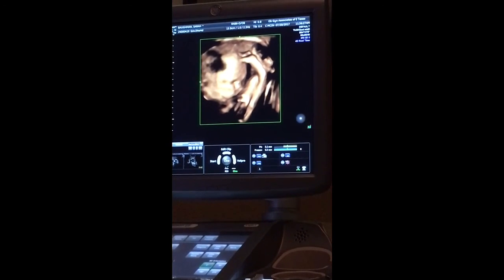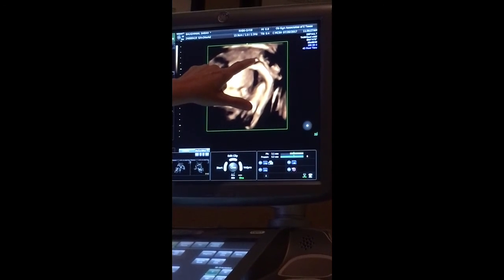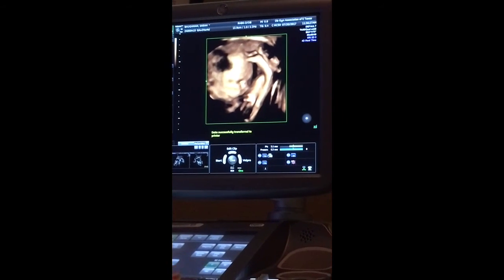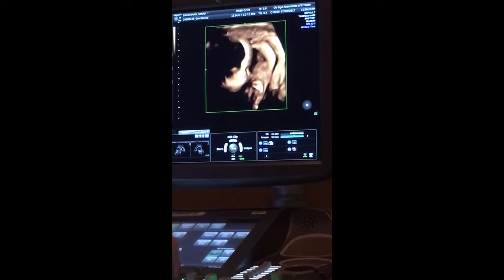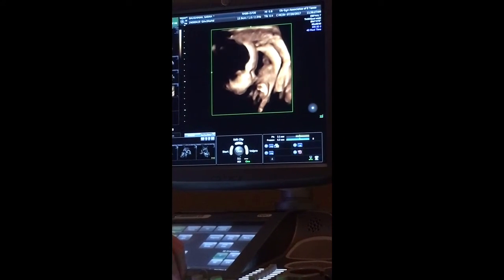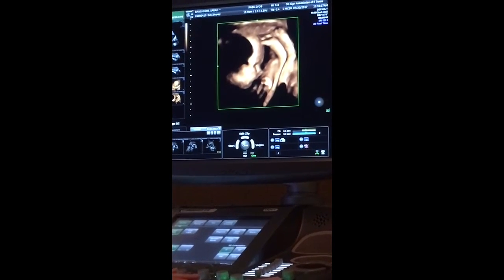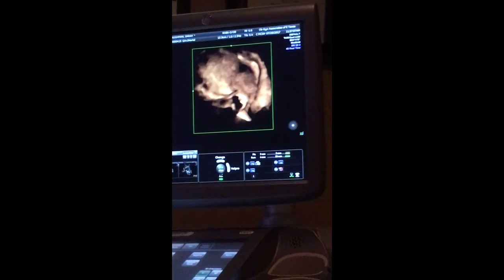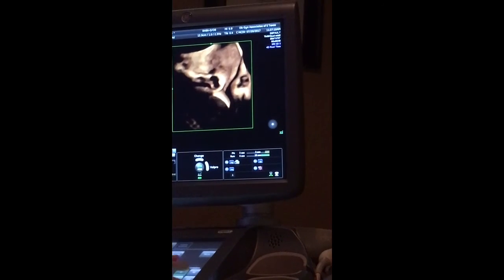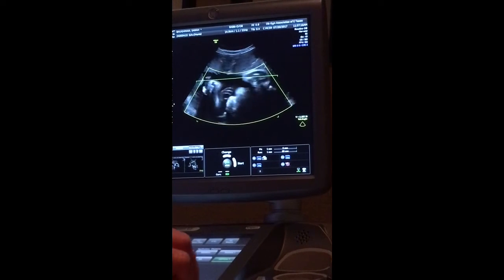Okay, so I'm straightening that up a little. Both of them. Nose. Her little feet. That's her arm, like touching her head. That's her leg. Yeah, a foot and a foot. Oh my goodness. She has some long legs. They're all stretched out too. That's cool. Look, you can see her feet there. See her little foot and her foot. She's flexible. She doesn't have a choice, she's in a little spot. That's why when babies come out, they stretch those arms and legs out, because they've been in such confined space for so long.